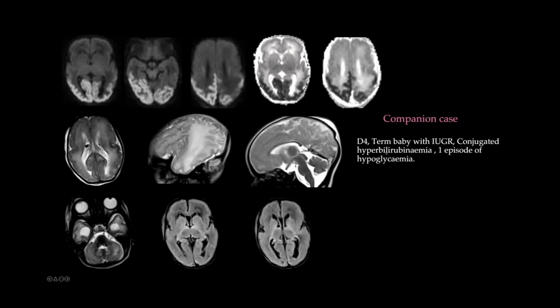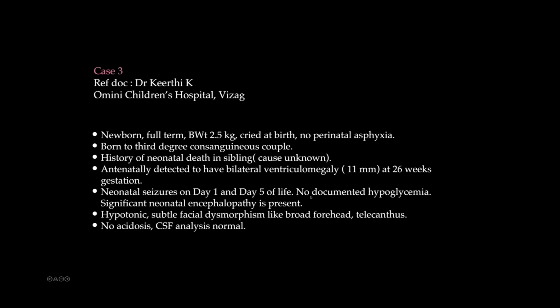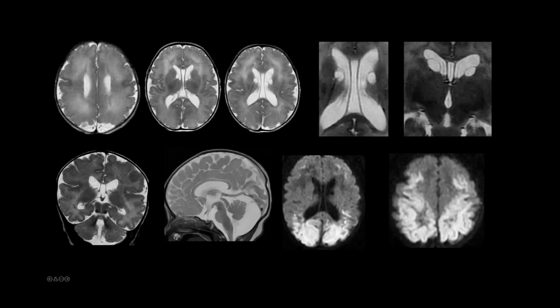This case was a child with hypoglycemia, whereas the index case, the presentation at least mentions that there is no documented hypoglycemia, but I would think the changes are probably consistent with hypoglycemic brain injury with or without hypoxic injury. The malformation and the subependymal cysts would probably point to a diagnosis of peroxisomal disorders such as Zellweger syndrome.